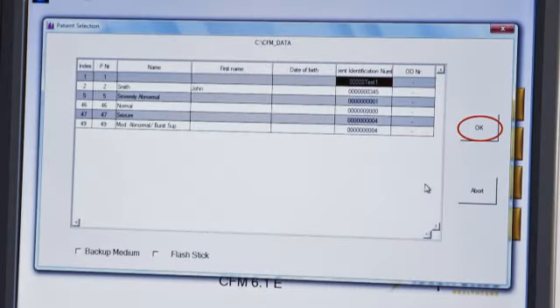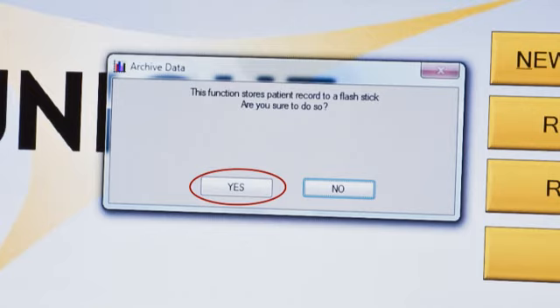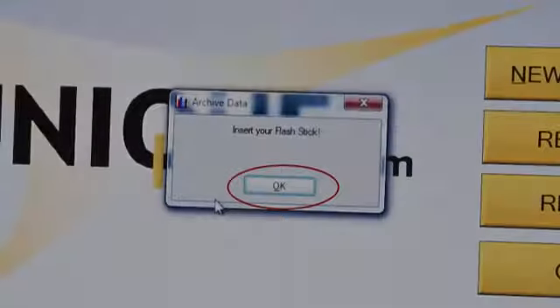Click the patient you wish to archive the data for. A message will appear asking if you want to archive to flash stick. Click yes.